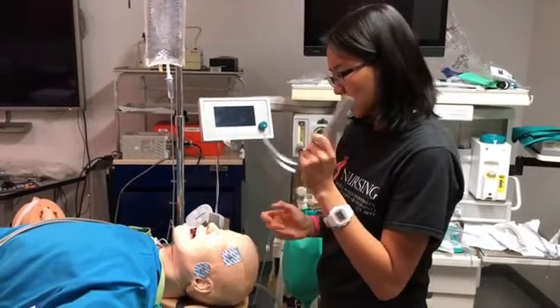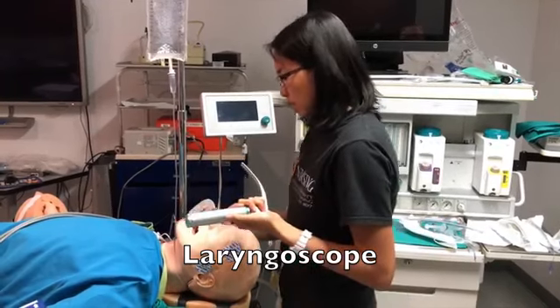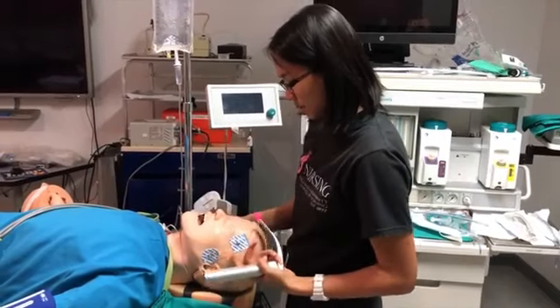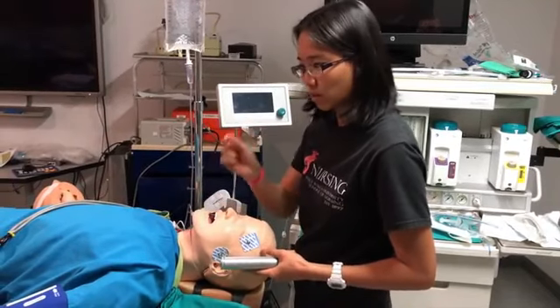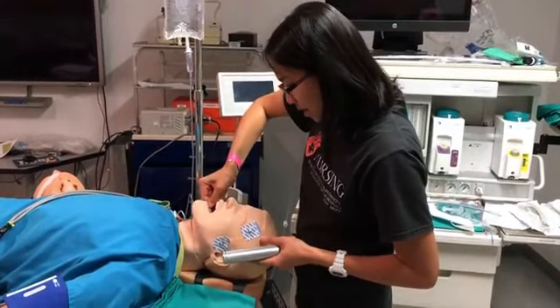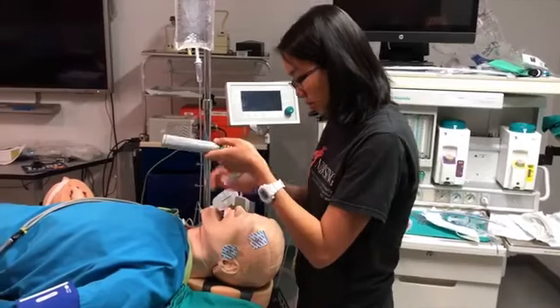So you want to have this laryngoscope in your left hand. When you get ready to intubate, make sure the neck's in the right position. You can do gentle extension of the neck, or just do a scissoring technique, and you extend it more in the mouth. It just opens up the mouth more, so you can fit the blade in.